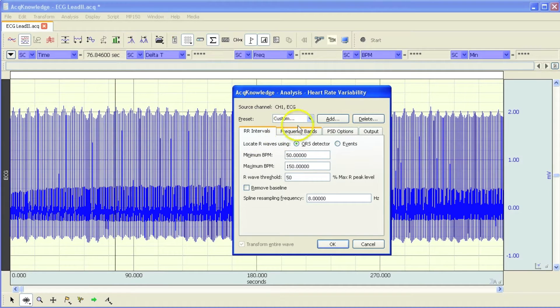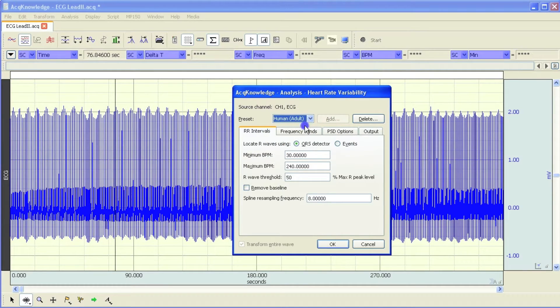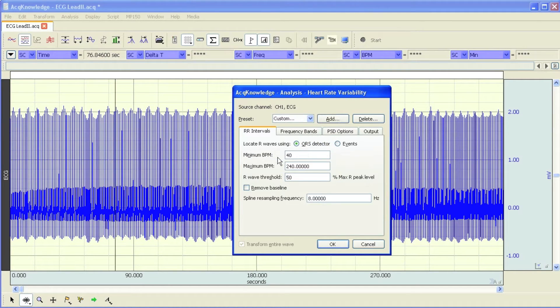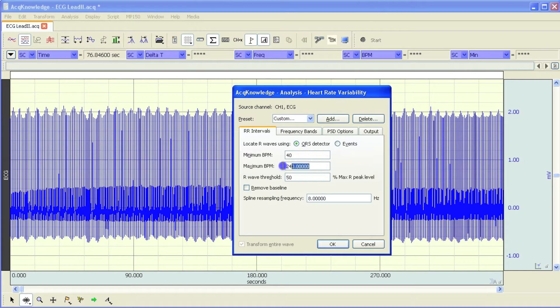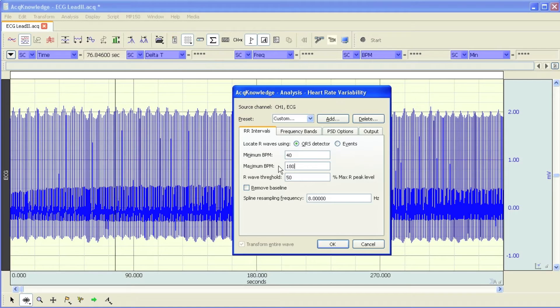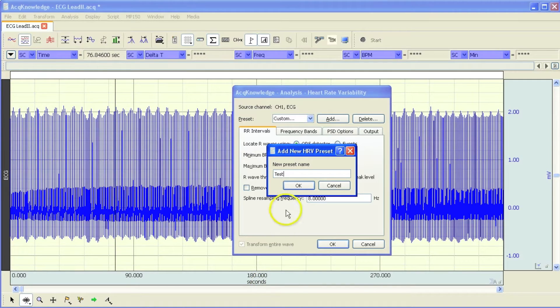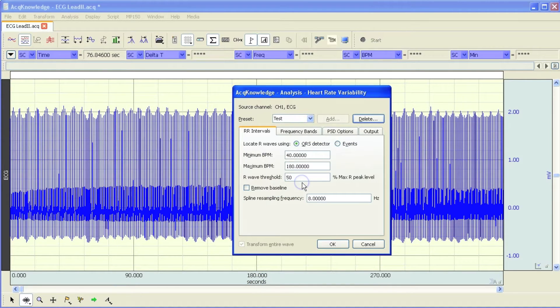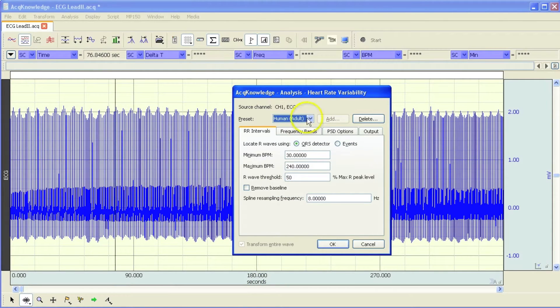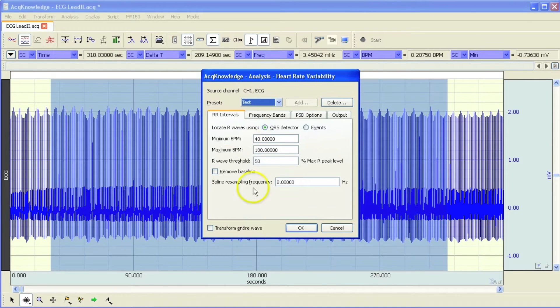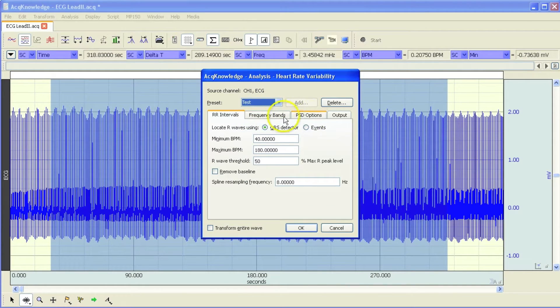It's also possible to create presets. It's got a preset that's already created here, but you can modify any of these settings. You can say, OK, well, my minimum expected heart rate is going to be about 40 beats per minute, and I don't expect my subject's heart rate to get above 180. I can create a new preset. Now we can toggle between these two modes quite easily.